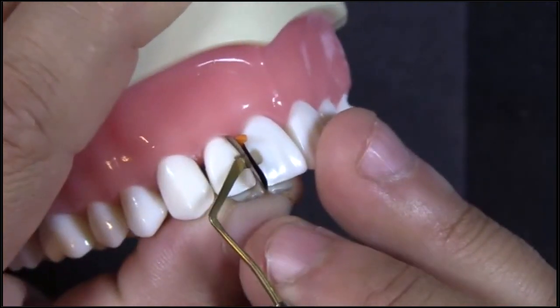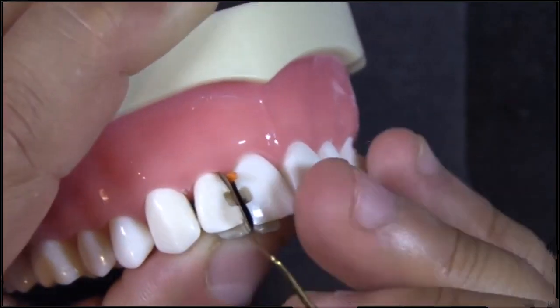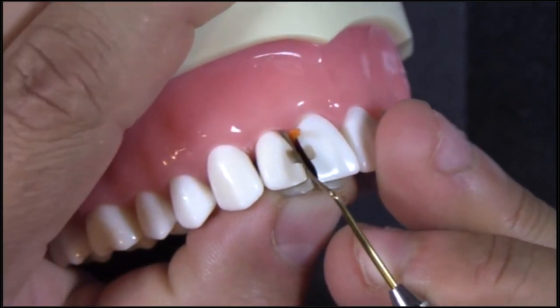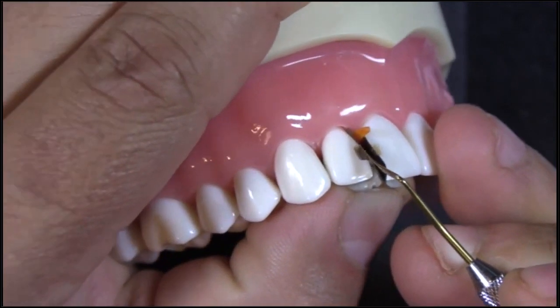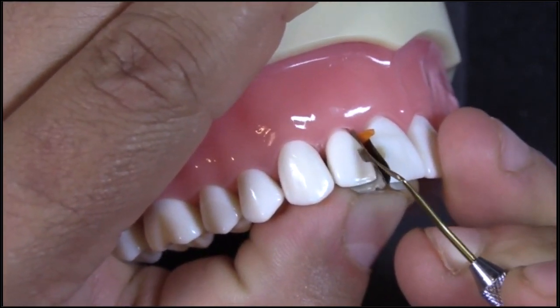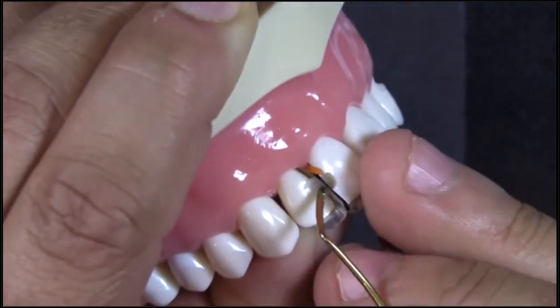What I don't like about that is it can leave an irregular line angle. What I like to do is called setting my line angle, where I take a flat instrument and just slightly fold it to match my line angle. When I do that, I'll have my assistant cure that restoration, and I can remove a little bit of excess if I have it.